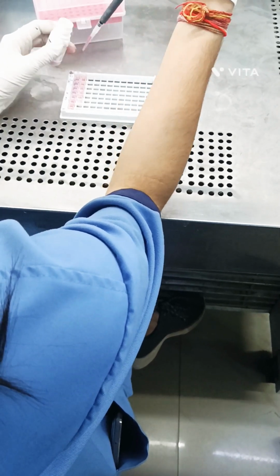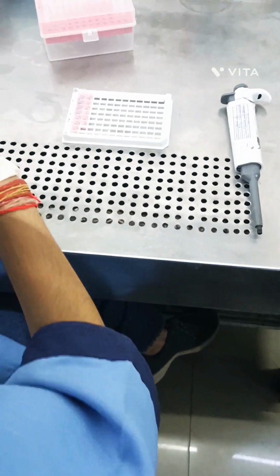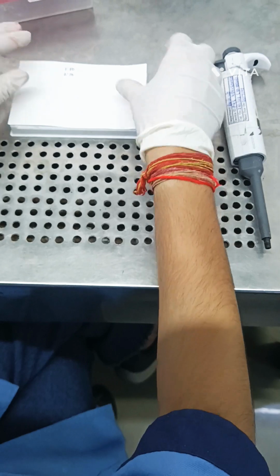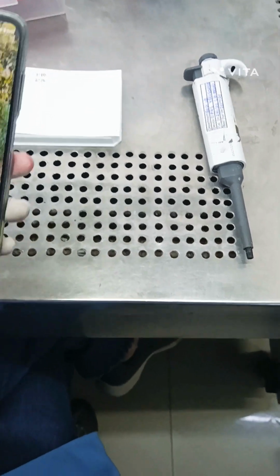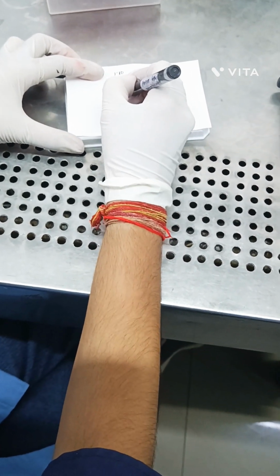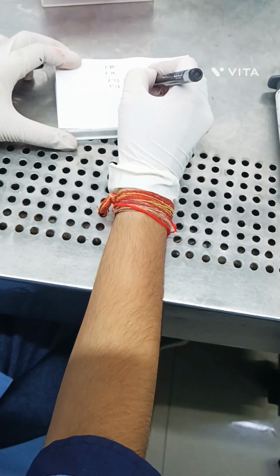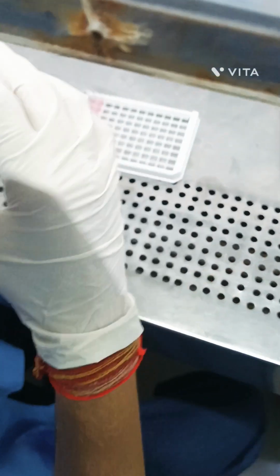Next step, again keep at 37° for 60 minutes and incubate in the incubator. So note down the time. Write it down on the label. This is very important: the time is noted down as per protocol.